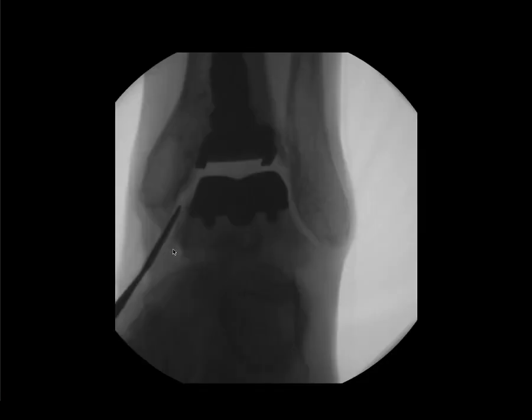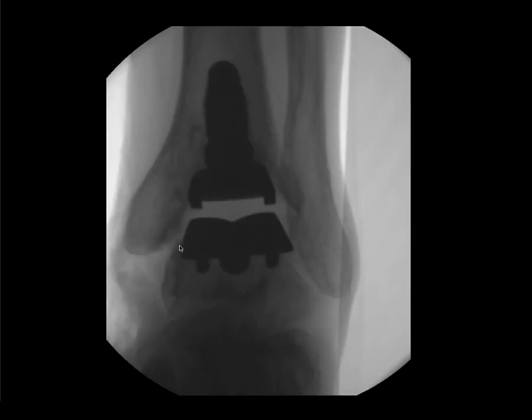The surgeon is lining things up just before the operation. And here's a fluoroscopic image afterwards showing us that this area has been cleared of osteophytes. And this lady did get a very significant improvement afterwards. Her ankle was a bit unstable, so she did injure her Achilles tendon afterwards, unfortunately, but it certainly improved her initial pain from this gutter impingement which she had.